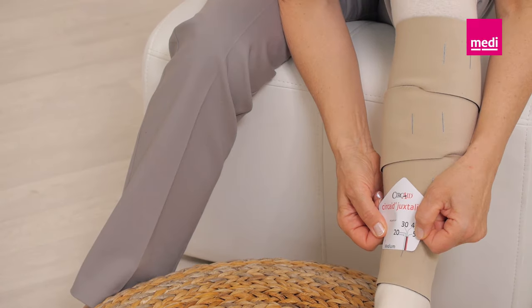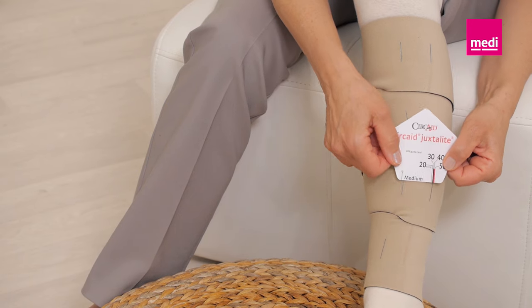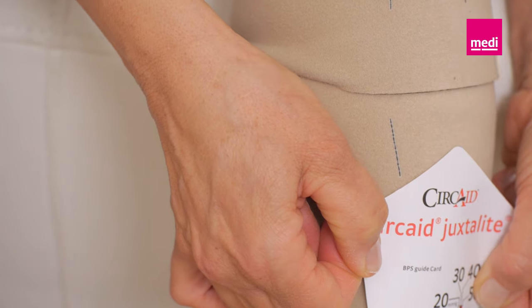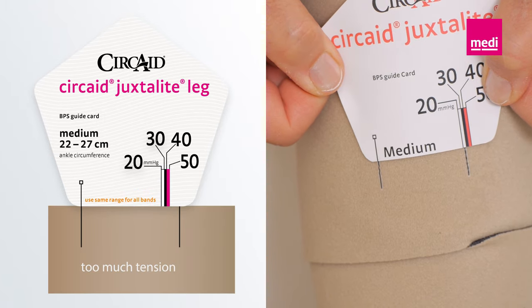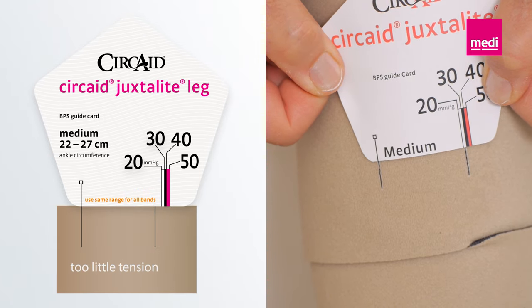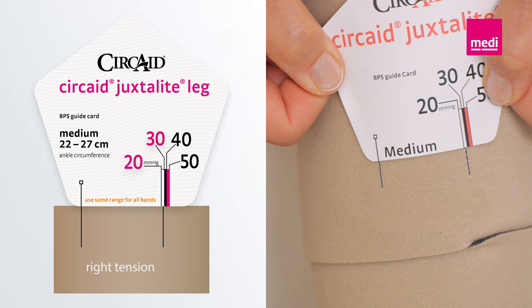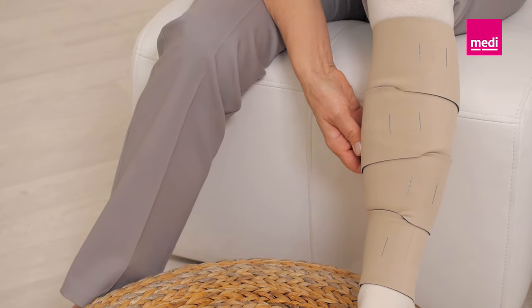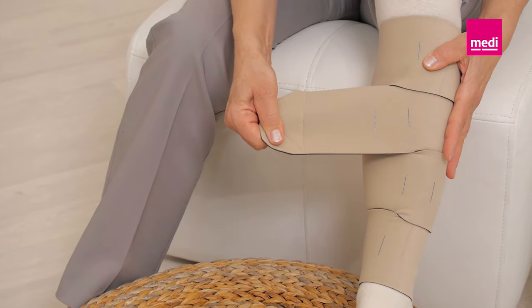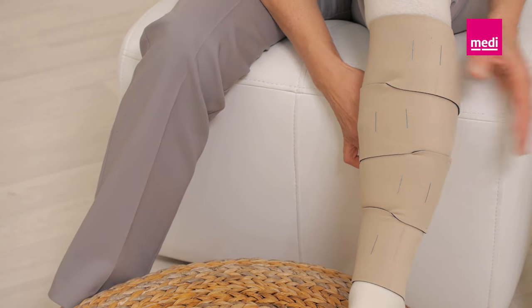To adjust the garment to your indicated compression level, take the BPS card and line up the vertical line on the card with one of the BPS lines on the bottom band. Note where the second BPS line lines up with the card's compression ranges. In this case, the patient needs 20 to 30 millimeters of mercury. If more compression is needed, tighten the band until the correct compression range is achieved.